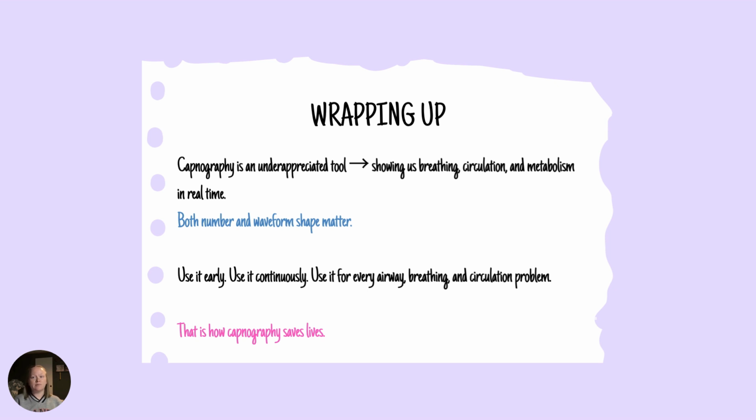So, just to wrap up, capnography, I think, is a very underappreciated tool. It shows us breathing, circulation, and metabolism in real time. So both the number and the waveform matter. Always pair end-tidal readings with your clinical assessment and the waveform shape.